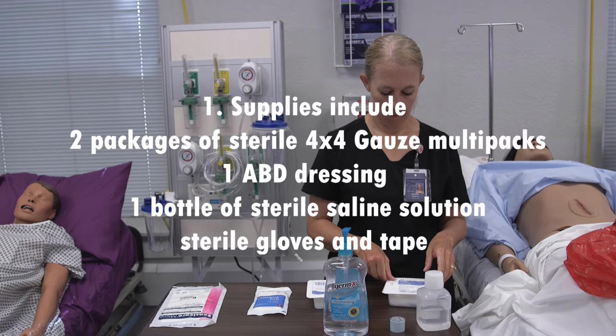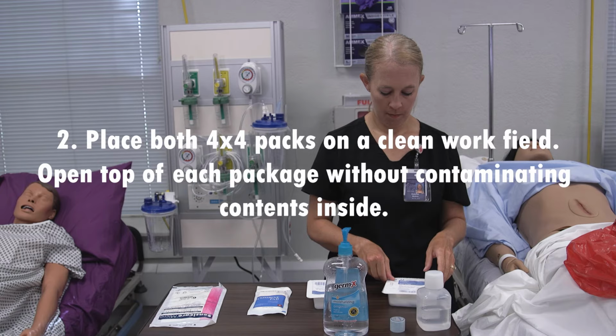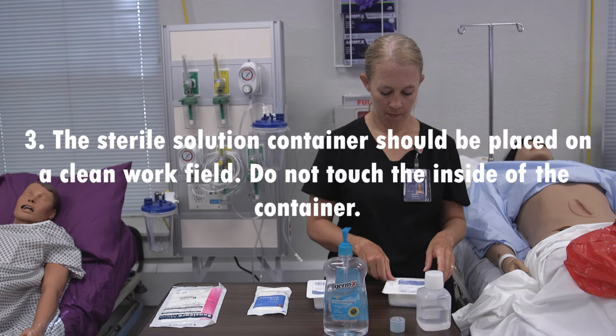Supplies include 2 packages of sterile 4x4 gauze multipacks, 1 ABD dressing, 1 bottle of sterile saline solution, sterile gloves, and tape. Place both 4x4 packs on a clean work field. Open top of each package without contaminating contents inside. The sterile solution container should be placed on a clean work field. Do not touch the inside of the container.